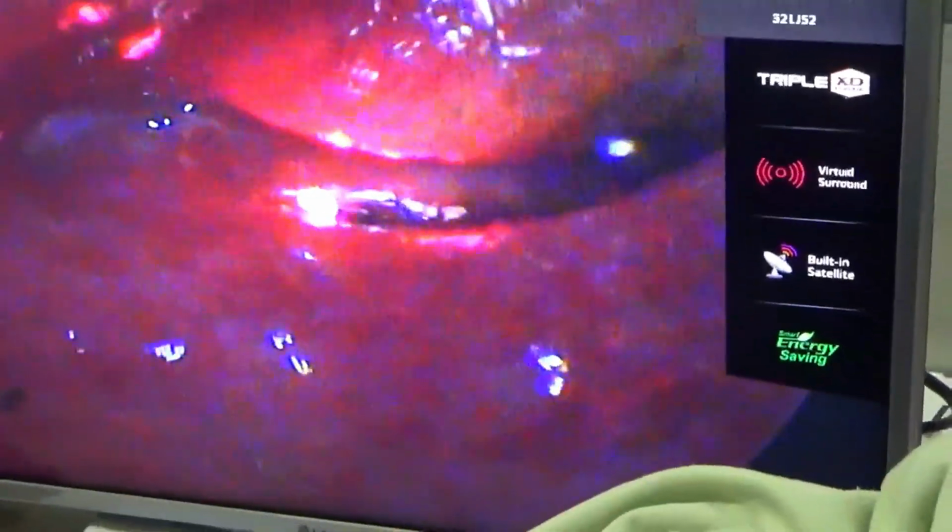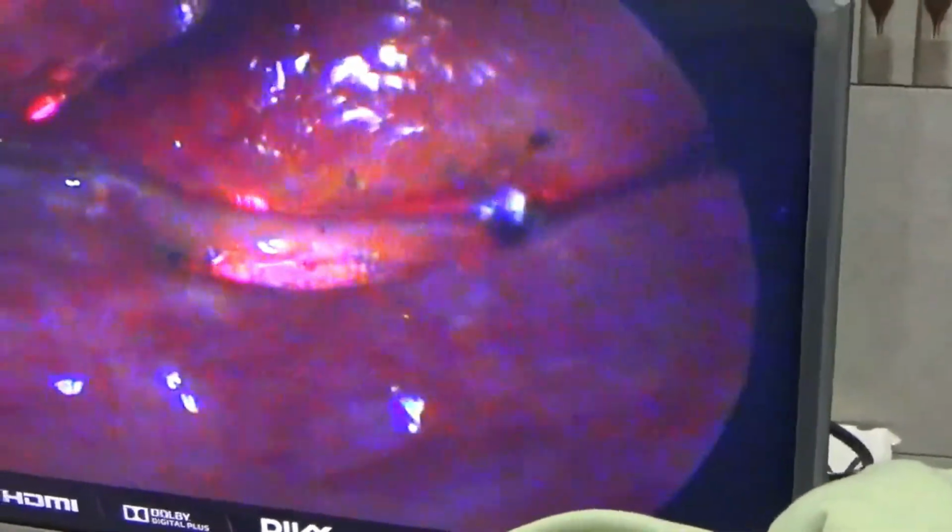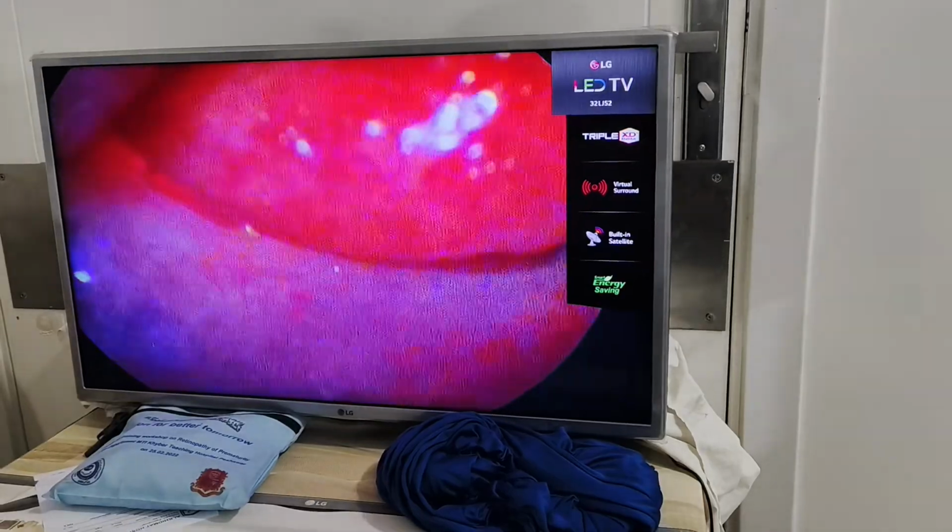The laser energy is given to the tip of the laser probe by pushing a pedal and it is pushed. In this way, it comes out in the nose by burning the tissue between the nose and lacrimal sac and a small hole is made. By moving the probe, this hole is made bigger horizontally as well as vertically until a good size of communication is formed between the sac and nasal cavity.